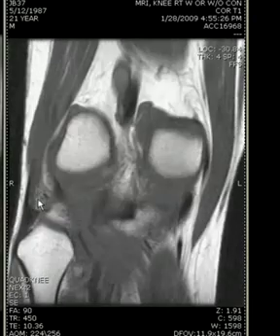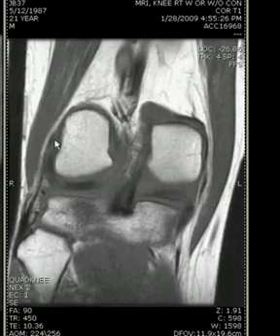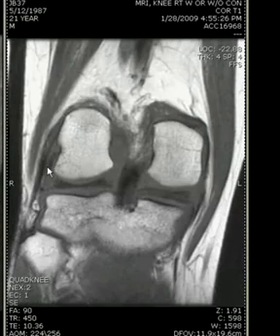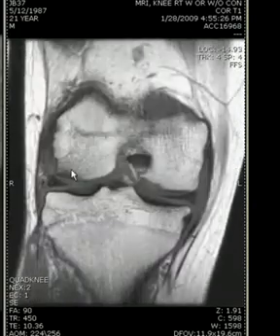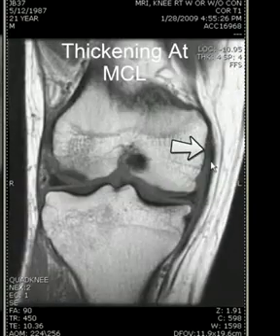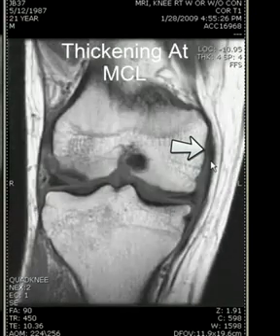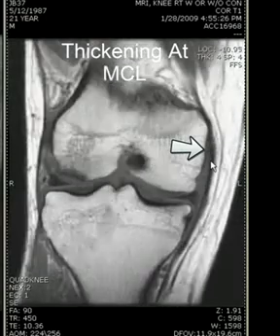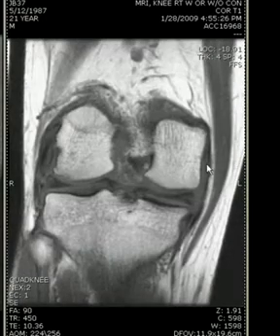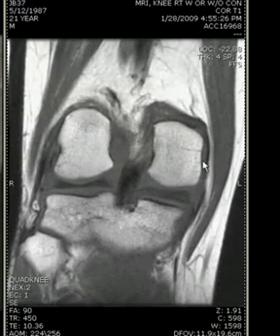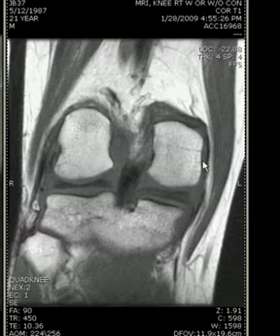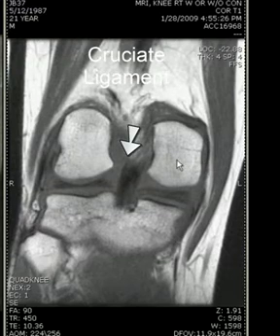On our coronal images we will look more extensively at the collateral ligaments. We can see the normal conjoint tendon, the normal fibular collateral ligament, and the normal iliotibial band. Immediately we have some mild thickening around the MCL with slight edema, representing a mild sprain. We always want to look at all abnormal and normal structures in multiple planes.